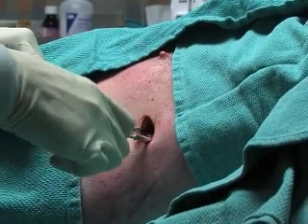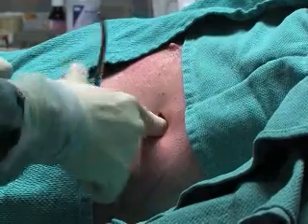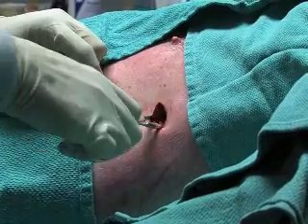When using a larger chest tube of sizes 24 French or greater, use your index finger to explore the tract being created by blunt dissection. This is done to ensure the larger caliber tube will be able to pass through the tract.